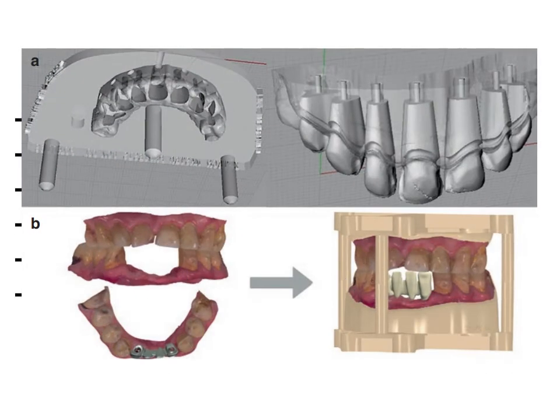The next one is the model builder or creator. This module is used to fabricate a physical model from a 3D file generated by intraoral scanners. The module would export the file for fabrication using a 3D printer or CAM devices. The operator can design the models to be hollow to reduce the printing cost, and with detachable segments to facilitate handling.